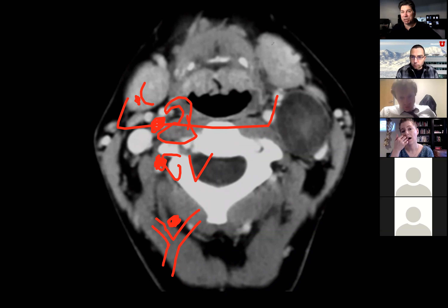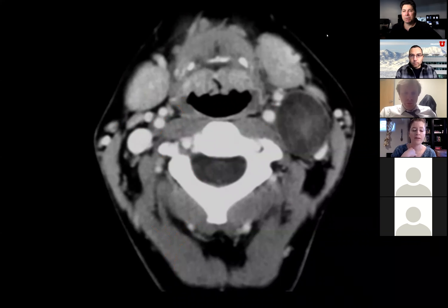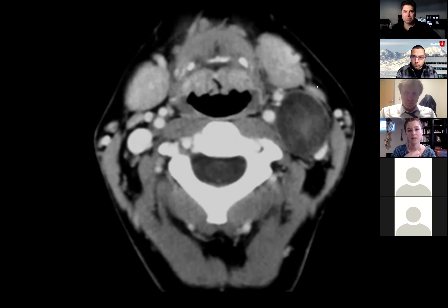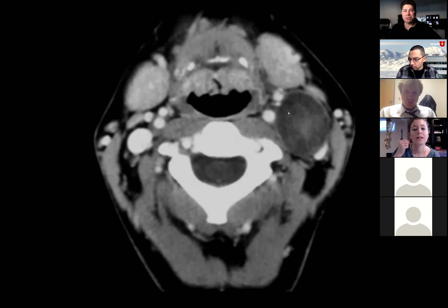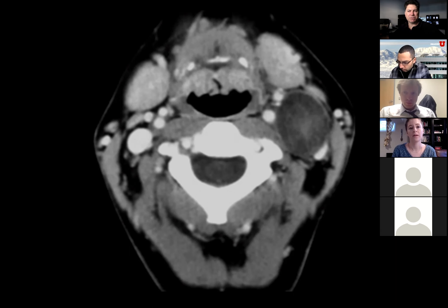Paragangliomas can happen in other places — rarely in the larynx. The vagale is centered two centimeters below the skull base; it'll be in between the carotid and the jug, just like this mass — but we usually talk about salt-and-pepper with those lesions.